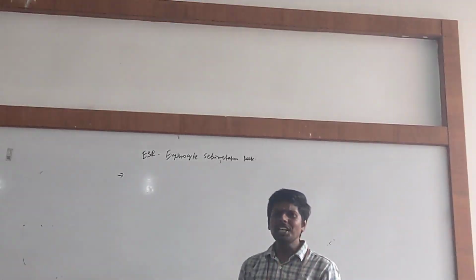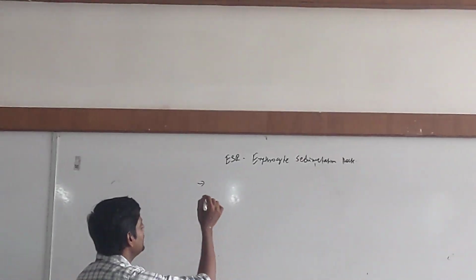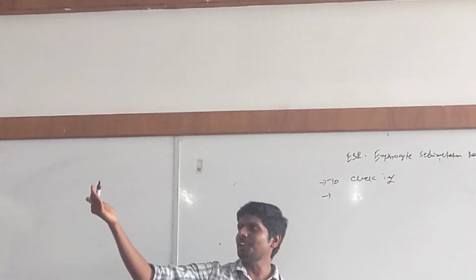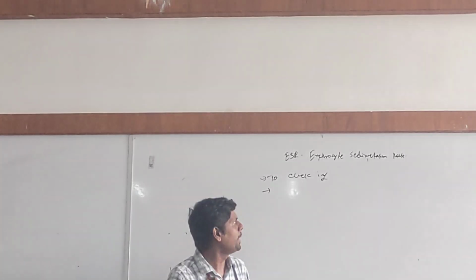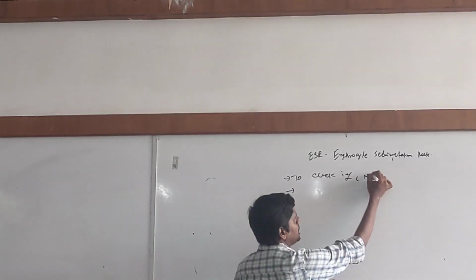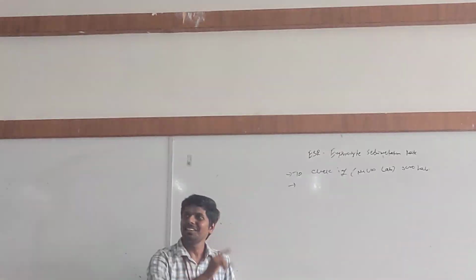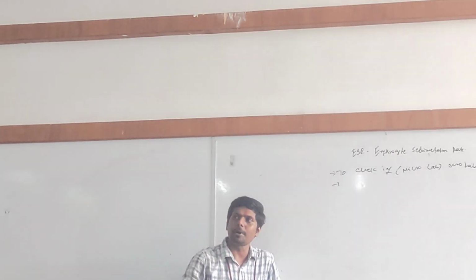ESR. So, what is the purpose of doing ESR? Ms. Simran said to check infection. Is that the correct answer? In one way that is correct, but I need a proper, accurate answer. What is the other purpose of performing ESR? Checking infection can be done in the microbiology lab, keep in mind. Then why do we have ESR in hematology? It has a connection with infection, but there is another purpose of ESR.